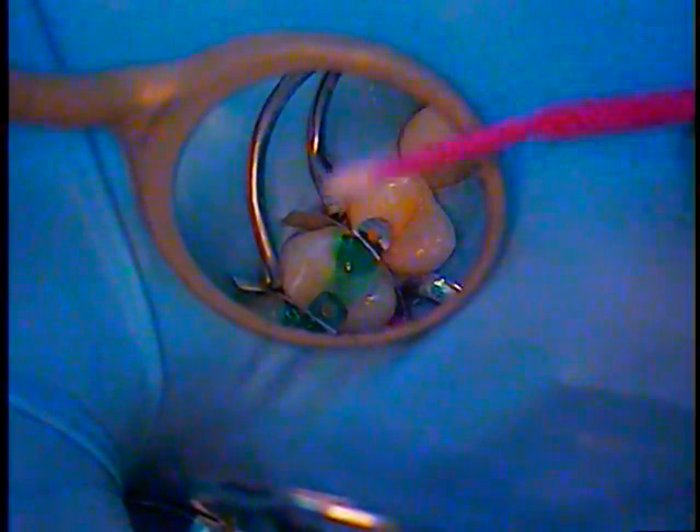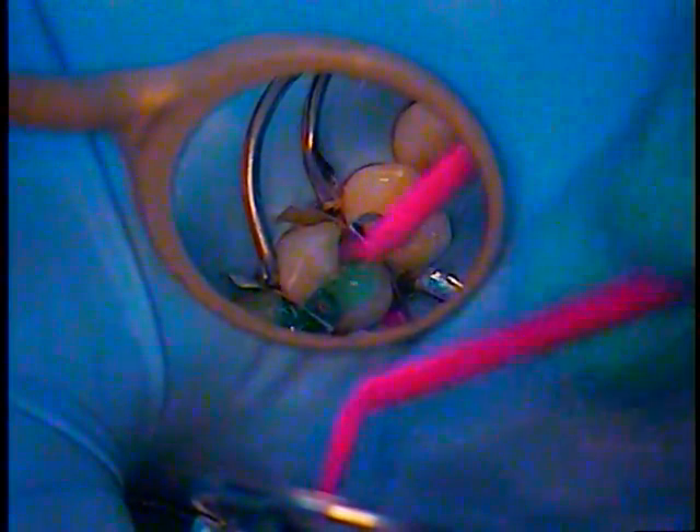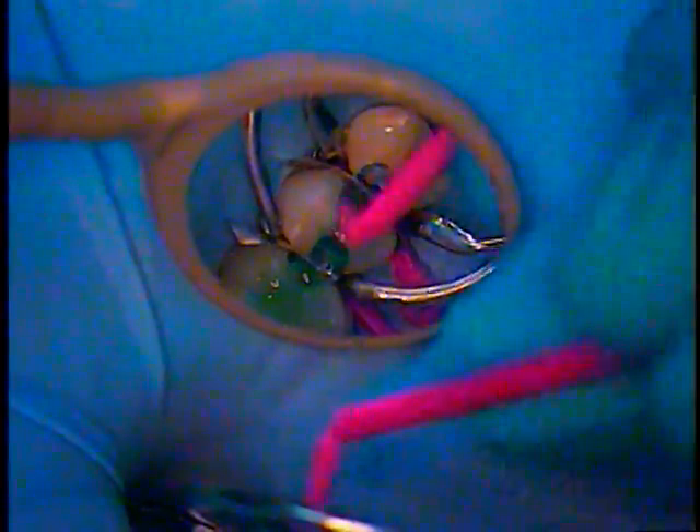Now we're going to etch everything. Follow it with the small brush — this is 3M's product. I actually had someone instruct me to really scrub that dentin. You can actually remove particles that don't come off with anything else. We scrubbed already with Cavity Cleanser.